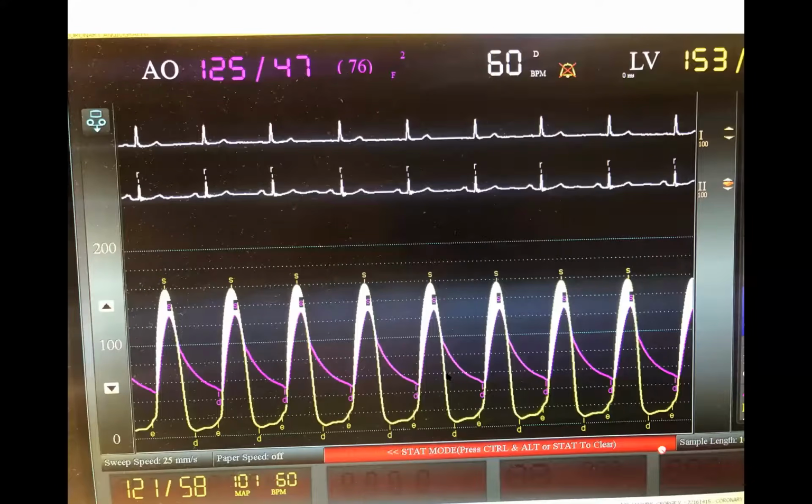When you're doing simultaneous LV aorta, you have to make sure we're using 2 pressure transducers. You have to make sure both those pressure transducers are zeroed at the same level. Okay, you have to ensure that none of them has what we call transducer drift, a zero drift in a sense that creates a false gradient or attenuates the gradient.